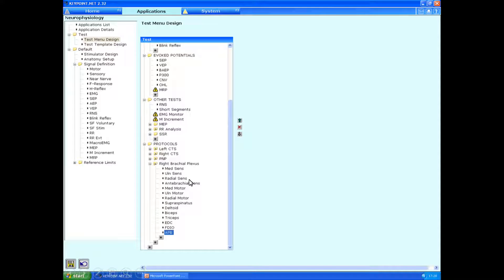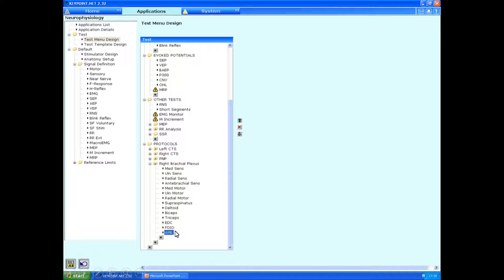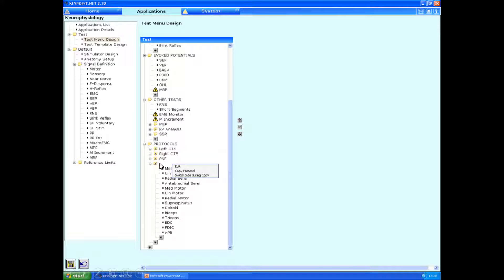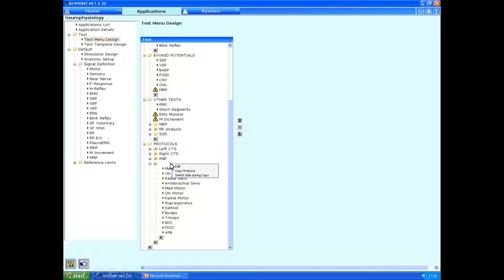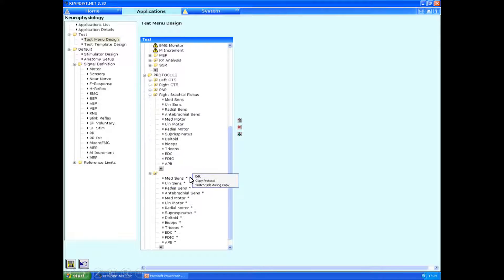I've now added in some extra EMG as well. And we can now save a tremendous amount of time by duplicating the tests, but for the left-hand side. So if you go to where the right brachial plexus protocol heading was, we right click on it and go switch side during copy. This will duplicate the entire set, but this time everything on the left-hand side.